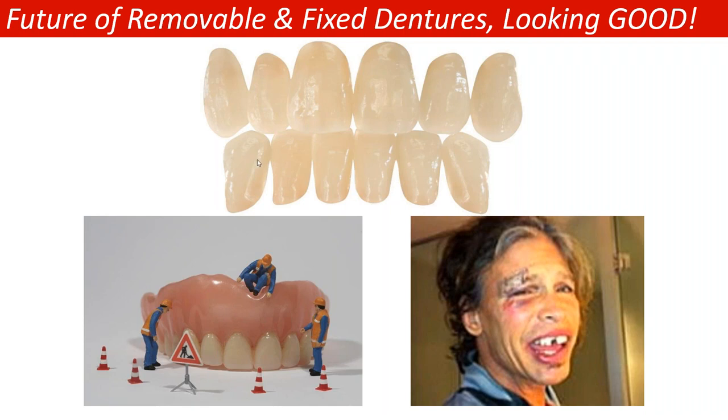We used VitaPan and Vita Physiodens at one time, but the anterior kept snapping off mid-tooth on mold, old dentures. Why was this an issue? This is a good question, because, and I hate to say it, Aaron, any tooth on the market will fracture. Depending on the patient, many patients actually fracture their natural teeth, and any patient that fractures their natural teeth can also fracture their denture tooth.